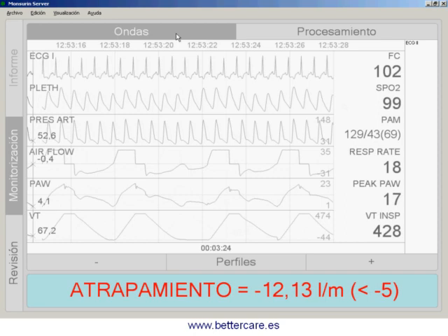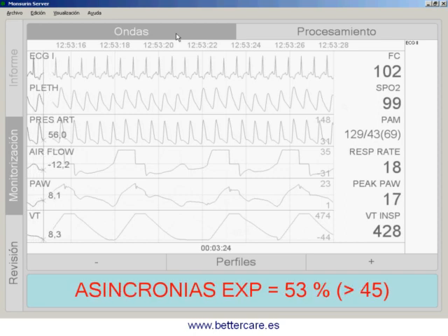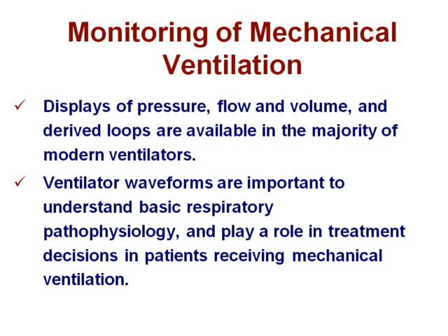We believe that this is important to provide context information at the bedside. Context information at the bedside is useful for us as clinicians to think and to decide what's going on. So, to conclude on monitoring of mechanical ventilation, my conclusions will be very basic.